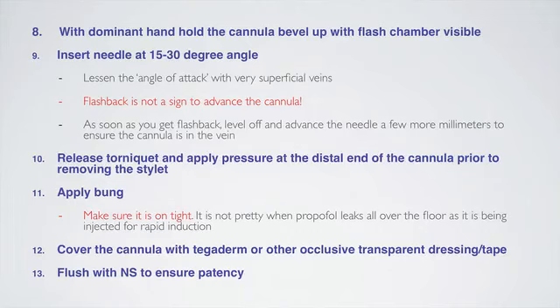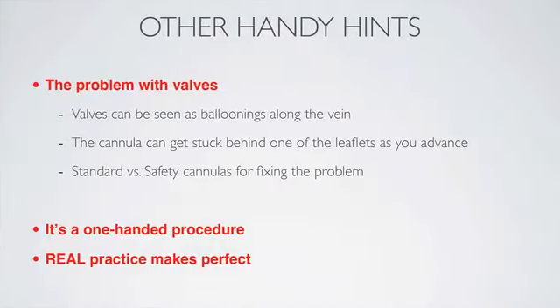Now, cannulation is really about practice. There are many different types of veins out there. Not one vein is the same, and you might have difficulties with certain patients trying to find a vein or even access the vein. So real practice does make the cannulation process a lot easier.